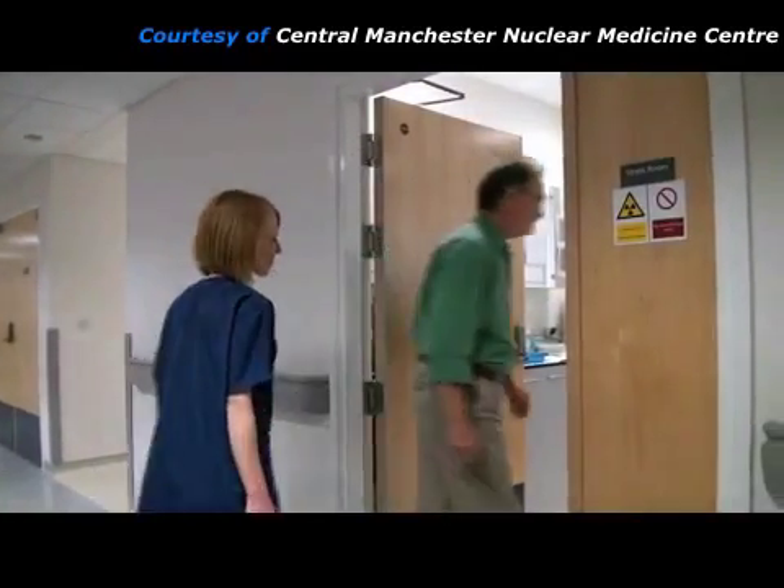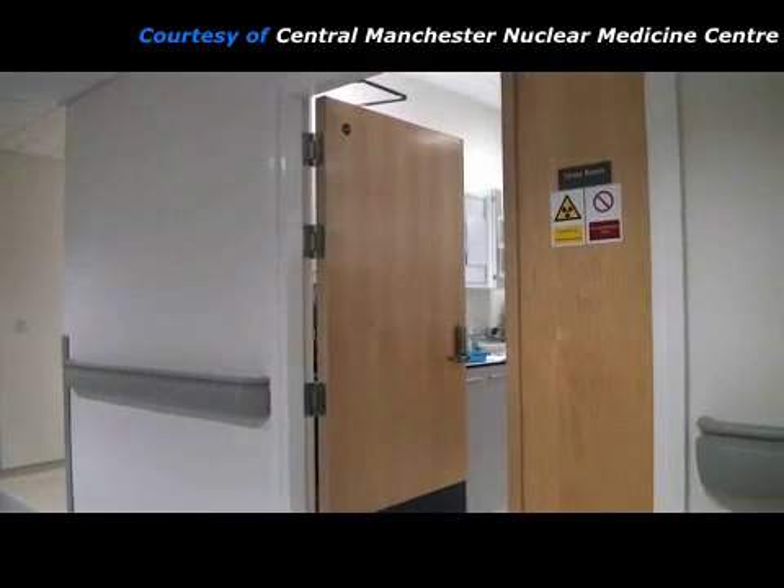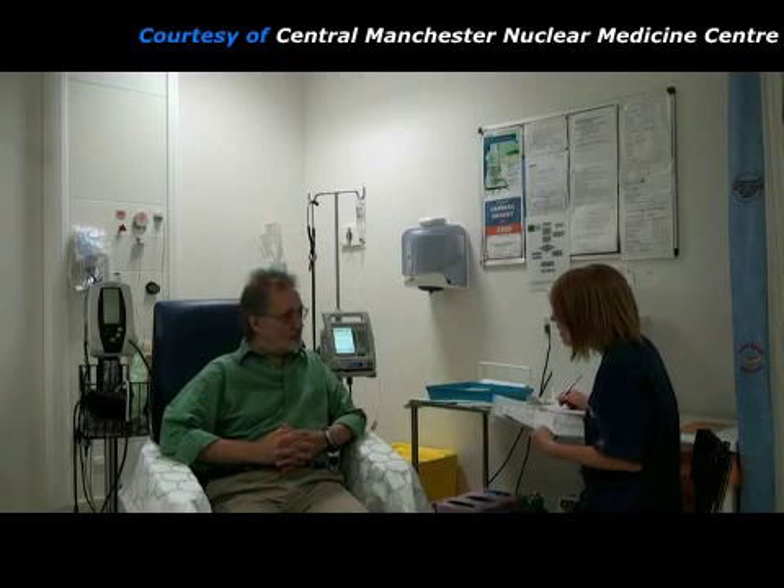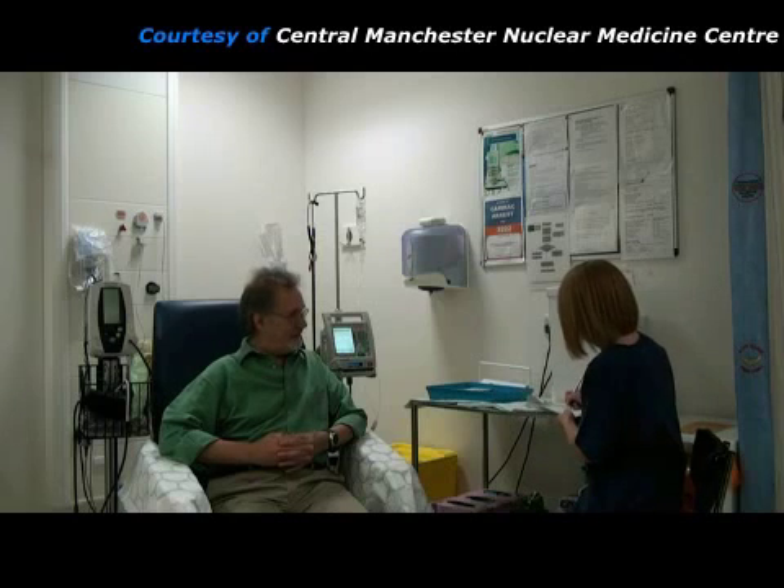They then go to the stress room. Here the practitioner checks the patient's identity to make sure she has the correct details. She asks the patient about his symptoms and checks that he has remembered any instructions about not drinking tea or coffee before the study. Then she explains what will be happening during the procedure and answers any questions that he might have.